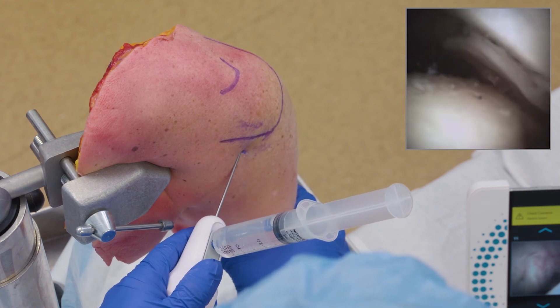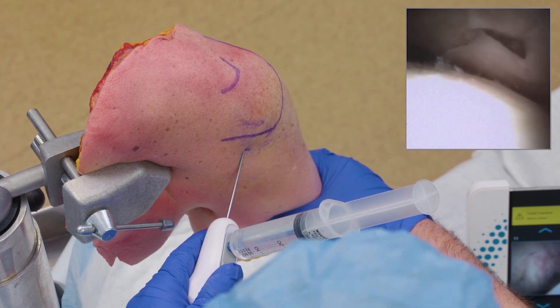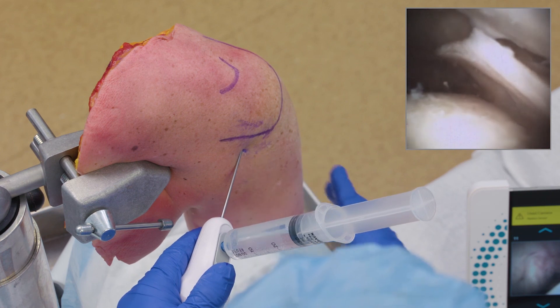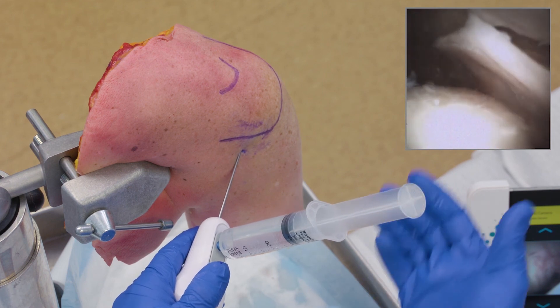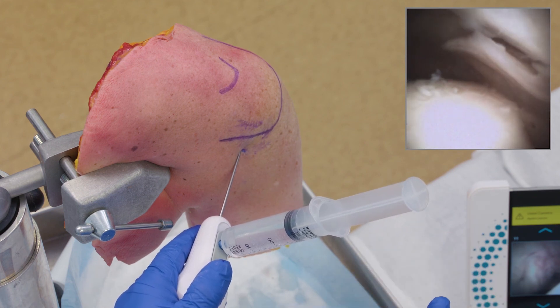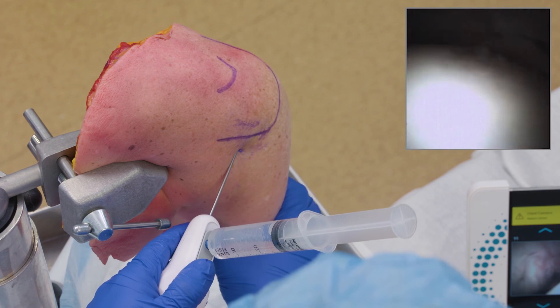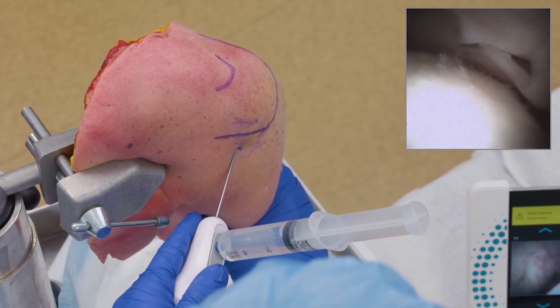One tip-off for a rotator cuff tear: if you insufflate 5 to 10cc's of fluid into the joint and the fluid's just not there or it didn't feel like it distended, odds are you have a tear in the rotator cuff because that fluid shot straight up into the subacromial space and blew up some of that bursa. You may find bursal tissue when you first come in — that's a tip-off. You can see this rotator cuff and dynamically evaluate it with internal and external rotation as well as abduction and adduction. So that's one more way to evaluate your rotator cuff tissue.